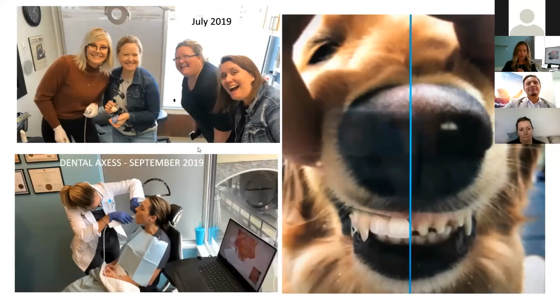So fast forward to July last year, I go spend some time with my other good friend Esther, and of course Erica and Carson. Spend a few days with Esther, and you can see Carson's got the TRIOS there, and you know, this was the selling feature for me.